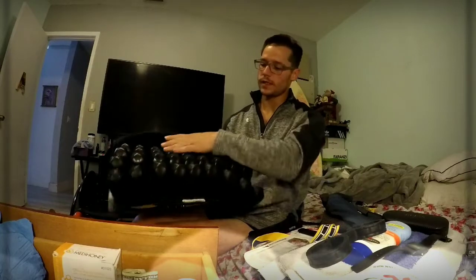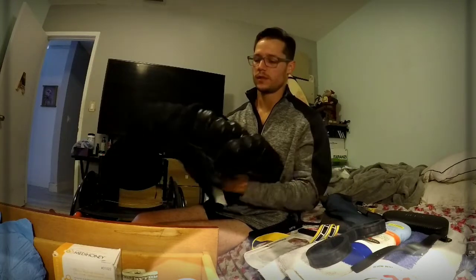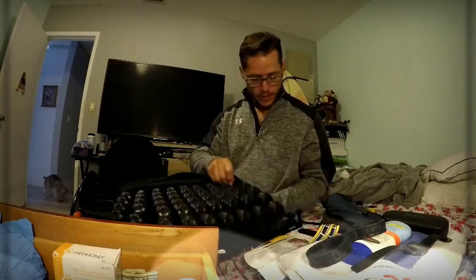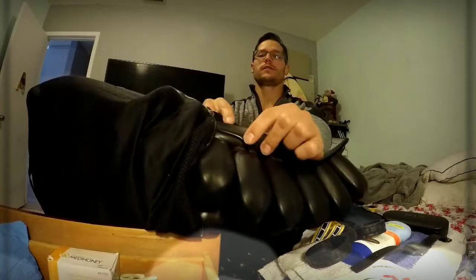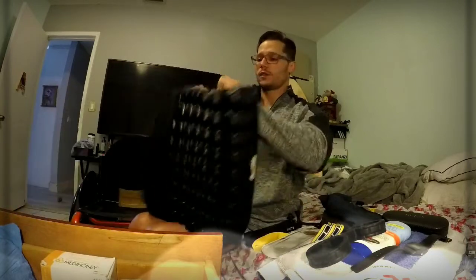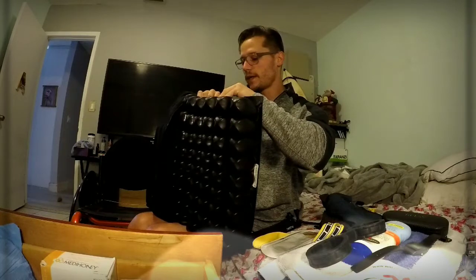And then after I do that, I take the cushion cover off, and well, you can take it off all the way. And then I get these little paper pins or paper holders. I get them because there are little valves here, little tunnels for the air to go to the quadrants. There are 4 quadrants. So these are the valves, or the air tubes, tunnels for the back.